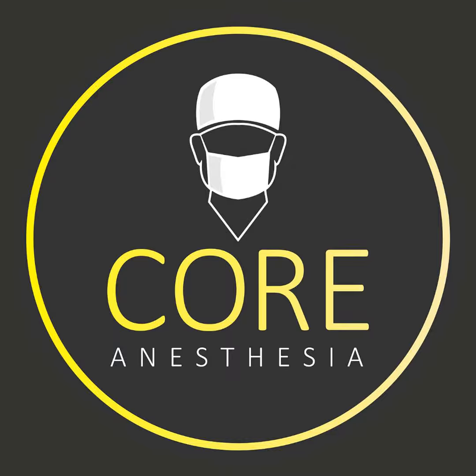This is where you want to spend your time, getting a really nice numbed up area. A little more time here, a little bit of discomfort here, is going to save them a lot of pain and pressure as you go through the rest of the procedure. And I think initially, starting out, I was really quick on this. You're just wanting to get to the next step or the more difficult portion. But this is important. You take the time to really numb up the area.